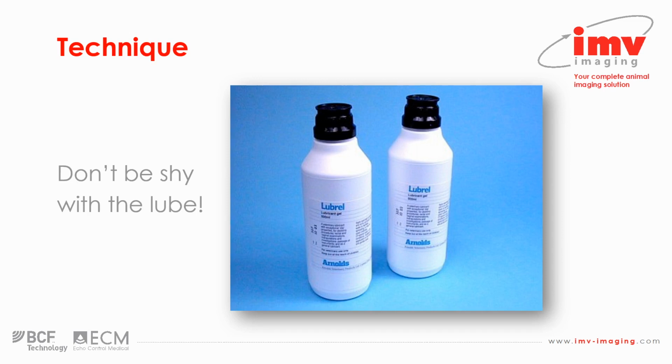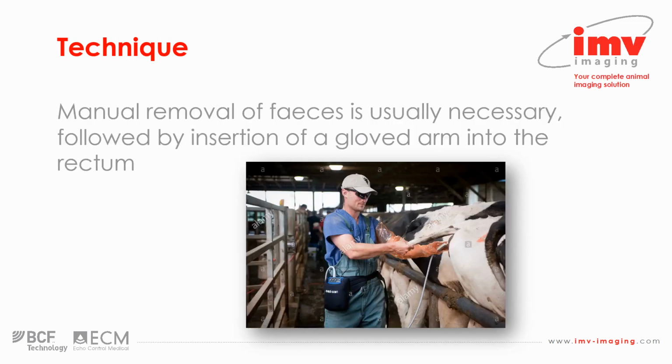You want to make sure you're not having to push too hard, you're comfortable, you're not damaging your shoulder, but also the cow is comfortable and isn't straining and trying to push you back too much, and plenty of lube can be a massive help.